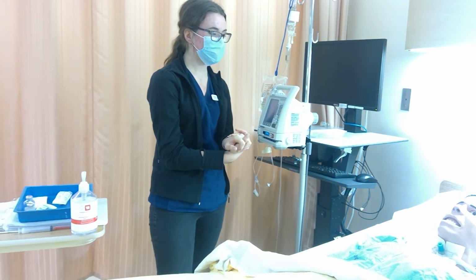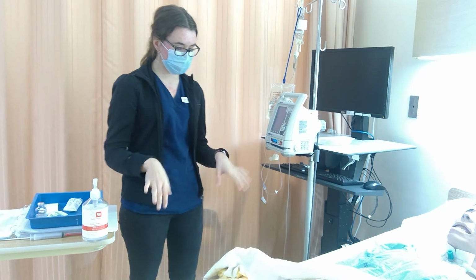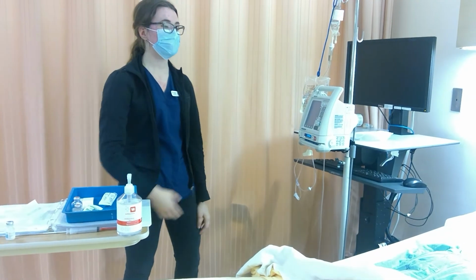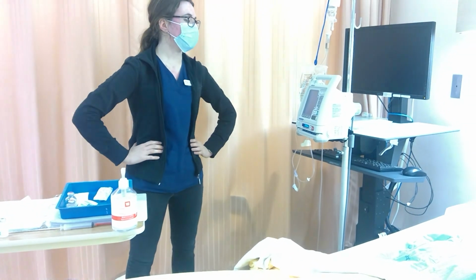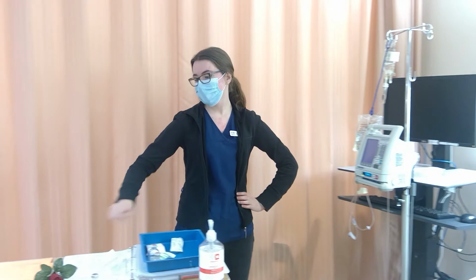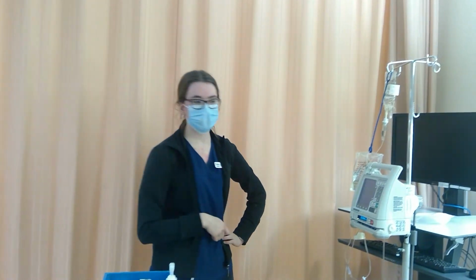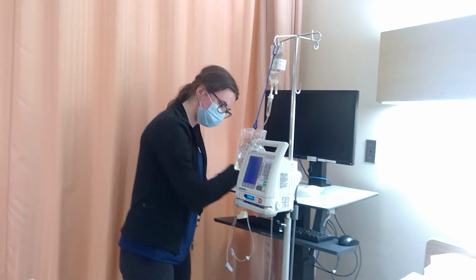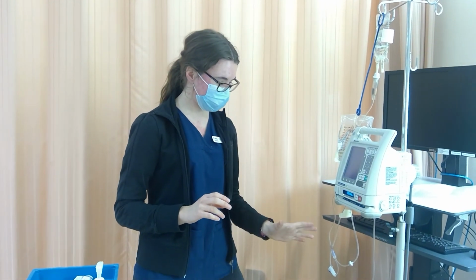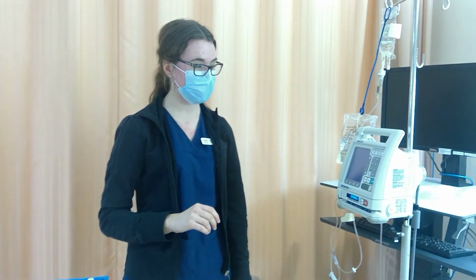I set it to beep so that it will call me back. And now I'm just going to do my last safety check. I see there's no hazards on the floor, the bed's in lowest position, the patient looks very comfortable, and our medication is infusing at the correct rate. So I'm just going to document in my MAR, and I'm going to document on the fluid balance sheet. And now that we have everything documented, we've gone through all of the 10 rights, and we've done the medication that's now infusing.